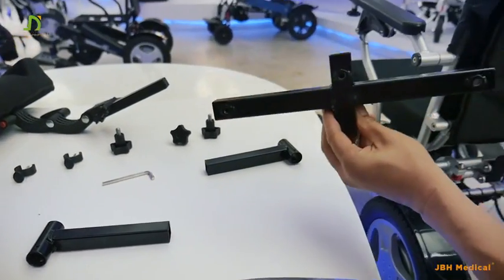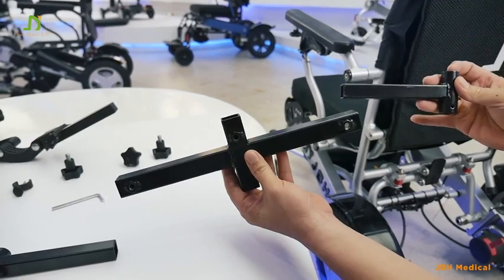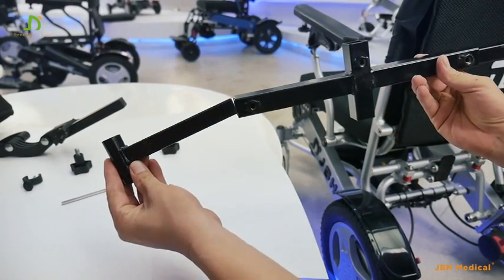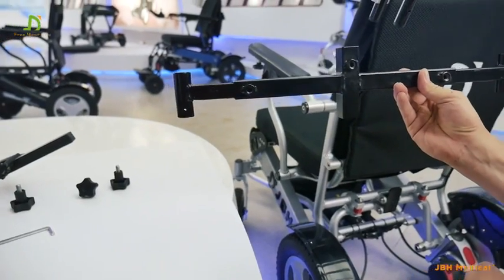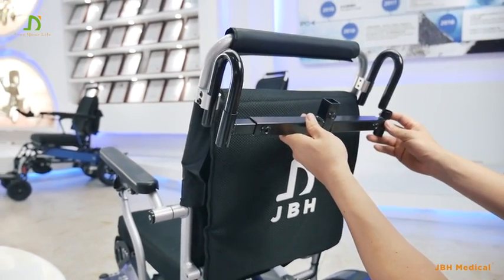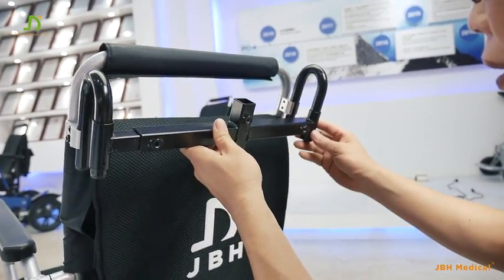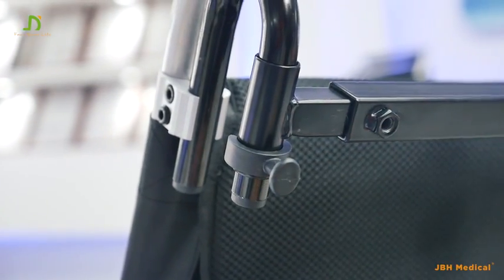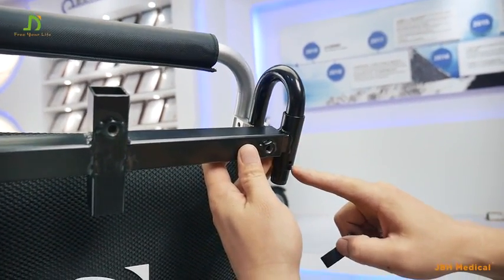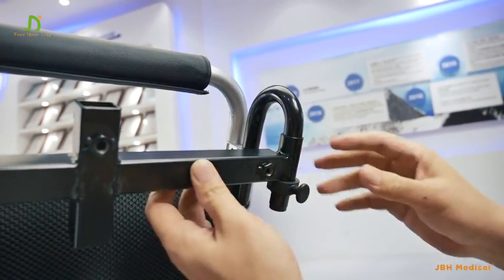Let's take out this part here. We are going to fit one of these with the hole facing towards the ground on the end, and the other one on the other hand. Now we can fix it here. Try to match the holes and make sure the hole here fits the hole in the pipe. Then we can pin it. Now it's fixed.